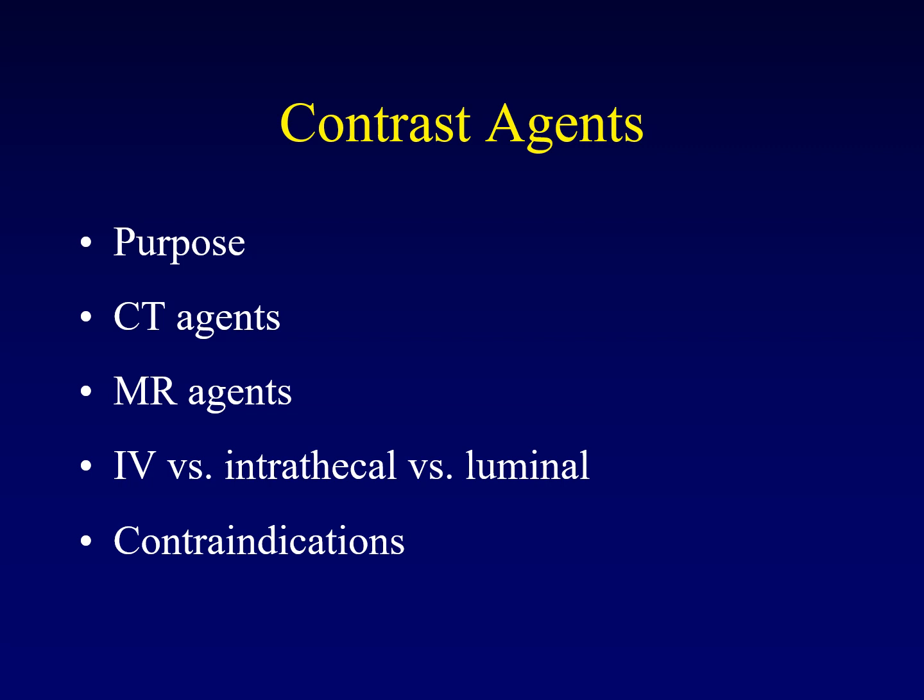Although we like to talk about contrast agents as intravenous, they can also be intrathecal, which was the myelograms we were talking about earlier, and they can be intraluminal, which we've talked about for fluoroscopic techniques like an esophagram.